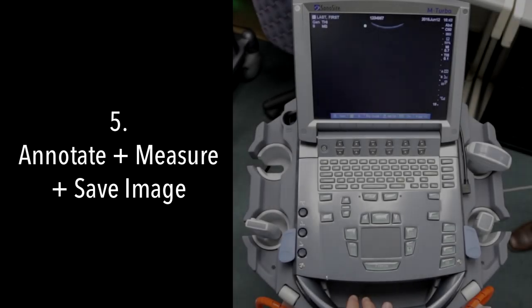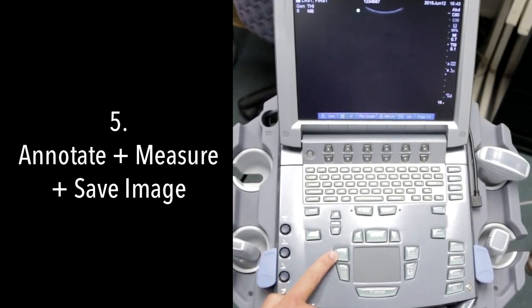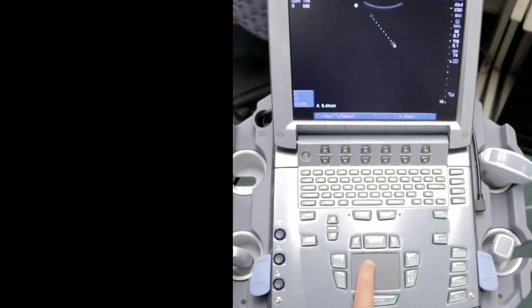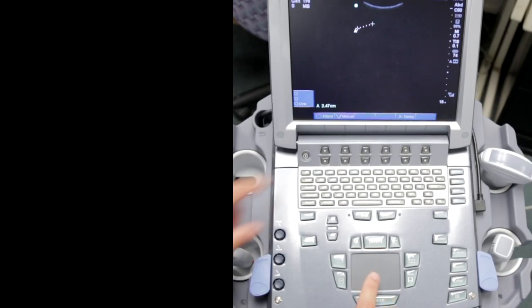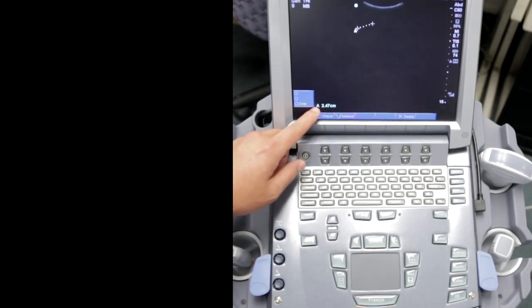If you want to measure something, there's a caliper button on the left side. You push caliper and measure from one point, then push select and you can change the caliper on the other side. The measurement appears on the bottom left of the screen.